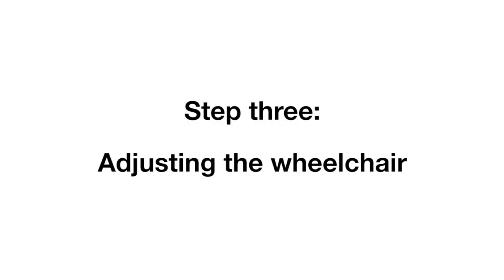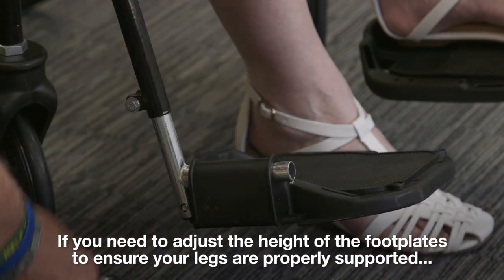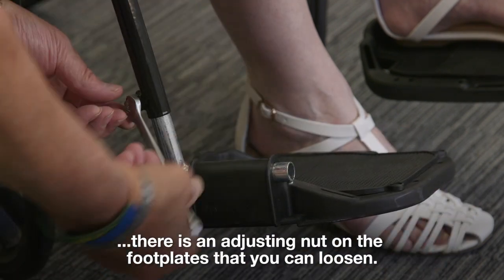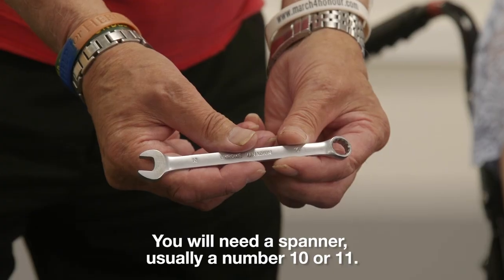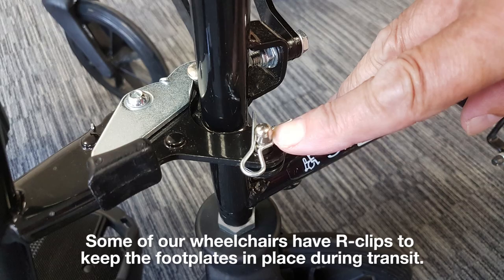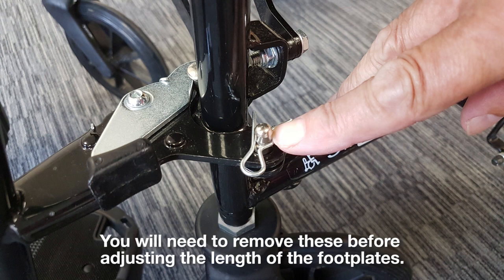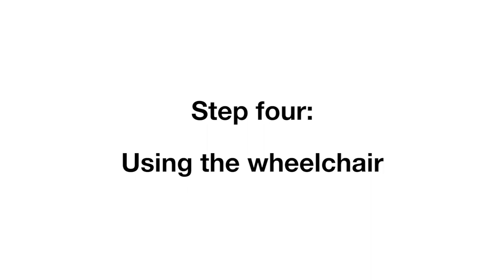Step 3, adjusting the wheelchair. If you need to adjust the height of the footplates to ensure your legs are properly supported, there is an adjusting nut on the footplates that you can loosen. You will need a spanner, usually a number 10 or 11. Some of our wheelchairs have R-clips to keep the footplates in place during transit. You will need to remove these before adjusting the length of the footplates. The R-clips do not need to be reattached to the wheelchair when you are using it.